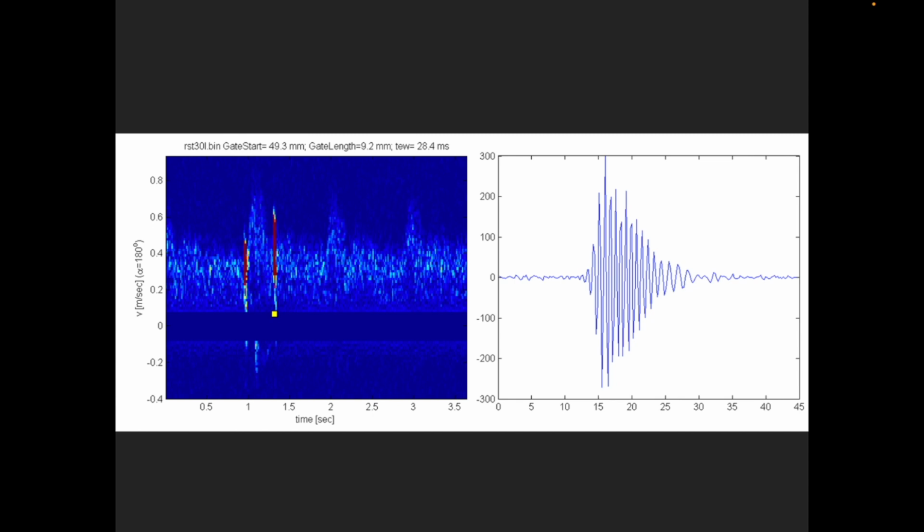We can, however, also look at an embolus in the so-called time domain, and not only in the frequency domain, which is actually the FFT. On the x-axis we again have time, but the interval on the right side is much shorter than on the left side. Actually, the time interval on the right side is equal to the duration of the small yellow square in the figure on the left side.